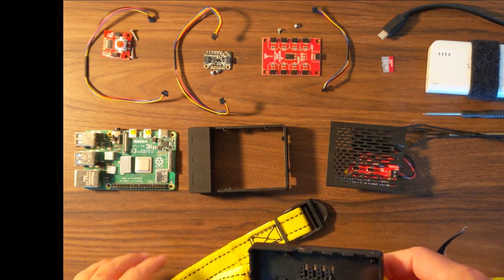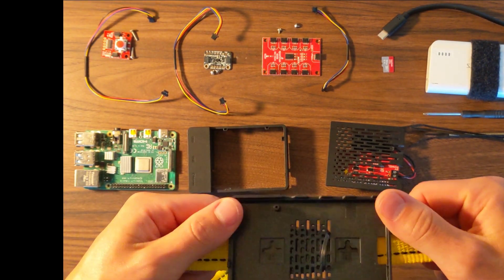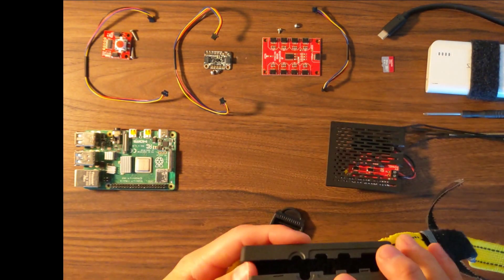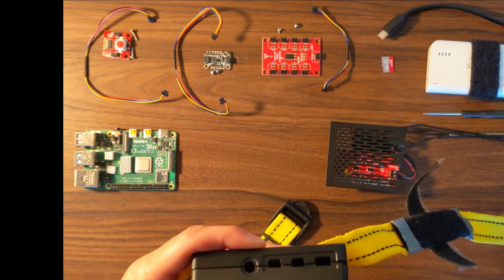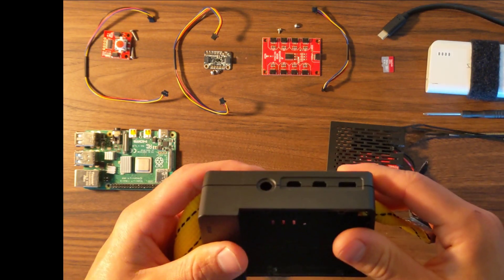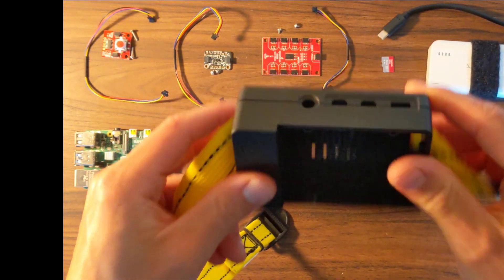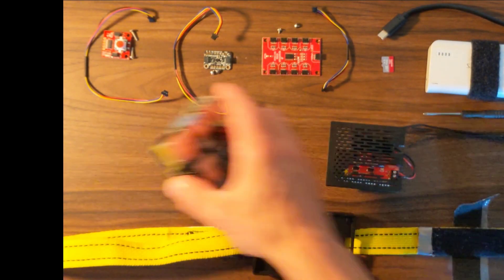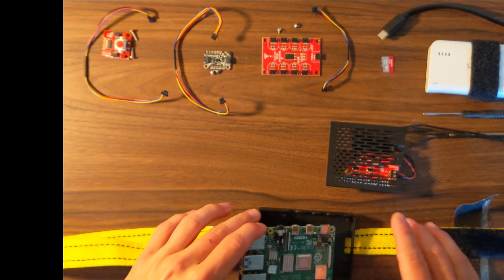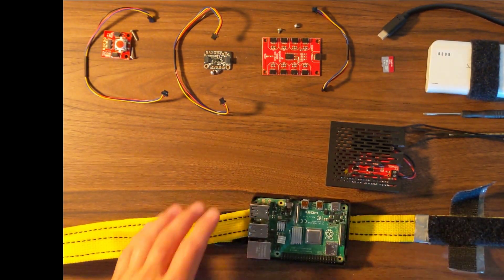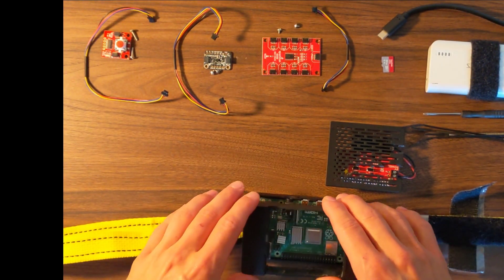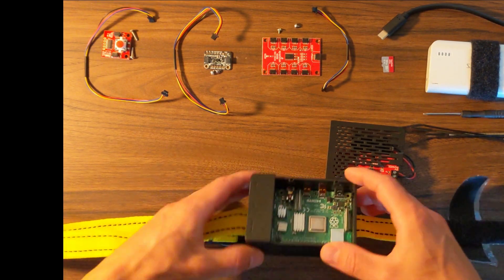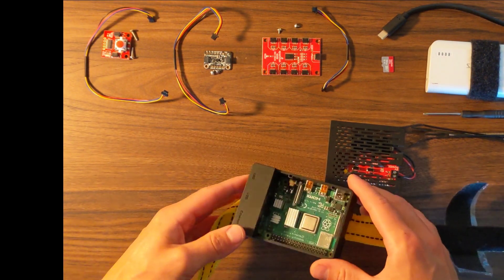You want to make sure when you do place this on that you orient the case with all the ports facing towards the person's head. So this would attach directly to their back. Take the pie and we'll place it on this bottom piece and we will go ahead and place on the second part of the case.